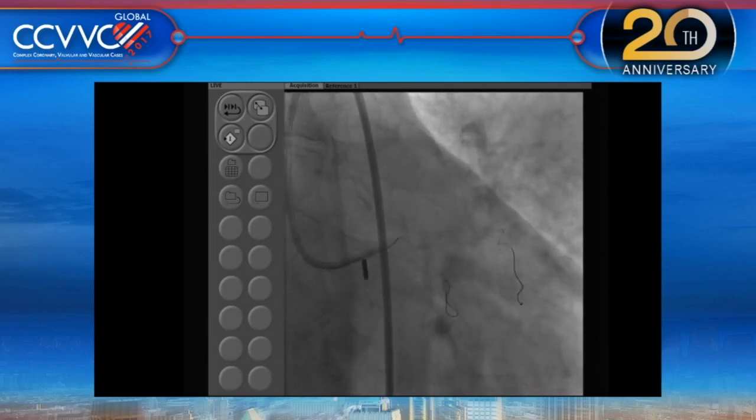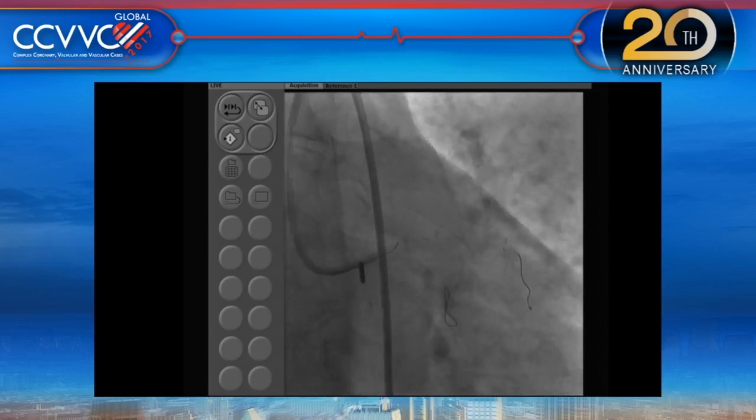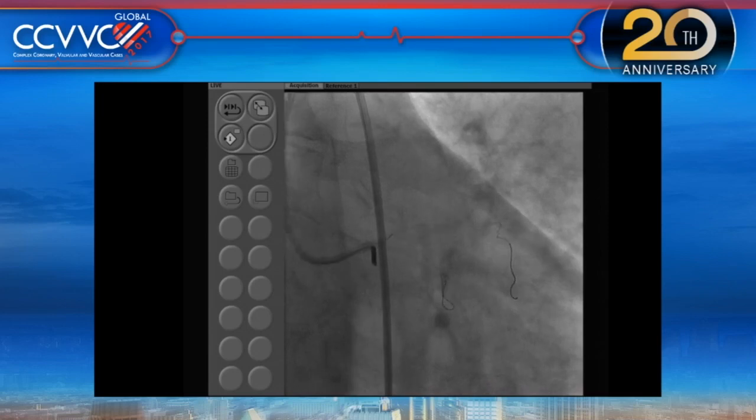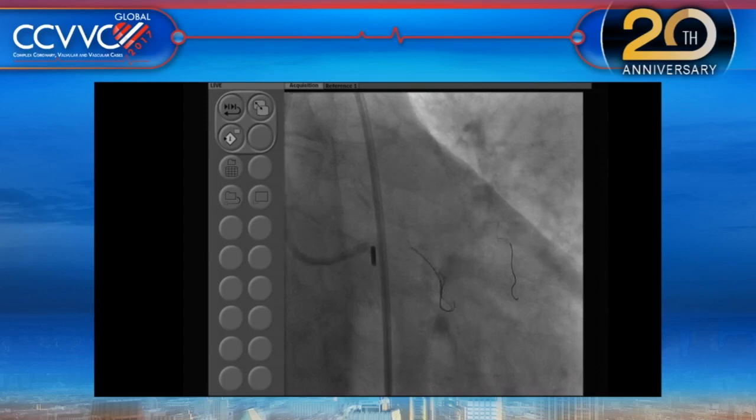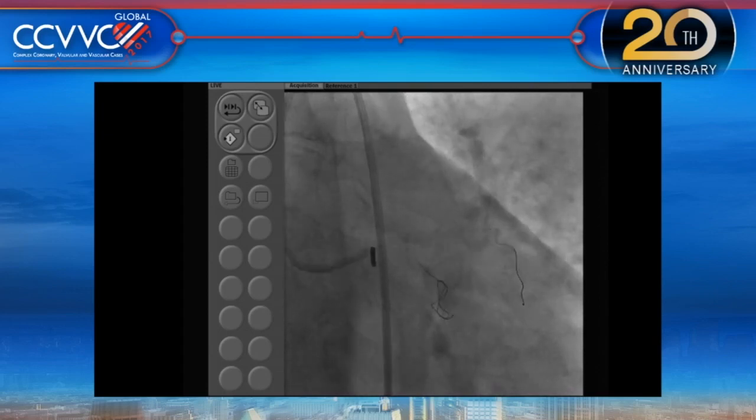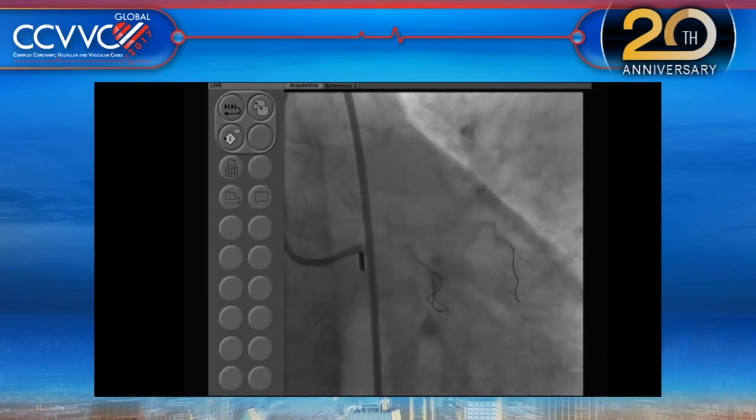Beyond the data we get from IVUS. And now actually, Samuel, Dr. Matthew can answer the question. Yeah. As far as the OCTs are concerned in left main, I have no hesitation in using it at all, because you get as much information as the IVUS is giving, even if it is calcified.